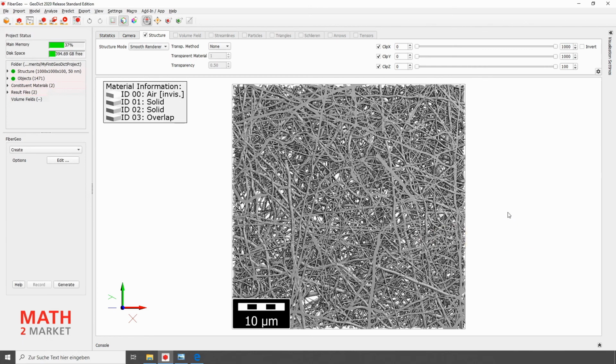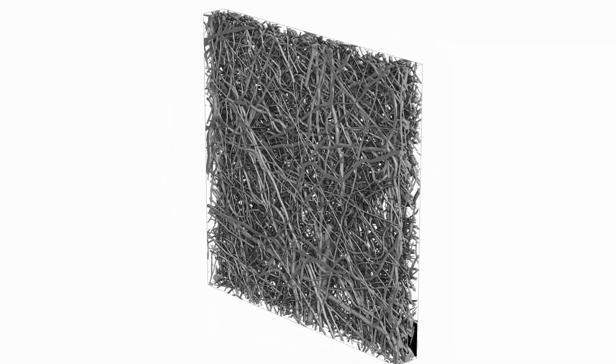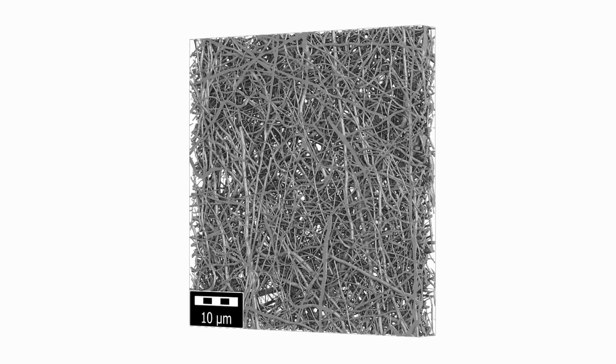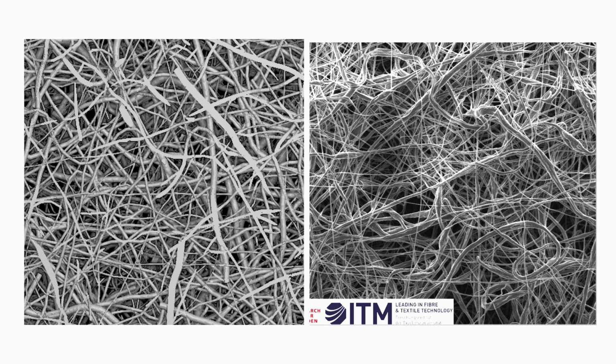And we're done. We use GeoDict's image processing and image analysis tools to extract the necessary information from the 2D SEM image. With this information, we were able to create a digital statistical twin using these as generation parameters for FiberGeo. The result is an accurate statistical model on which we can now perform further property calculations.